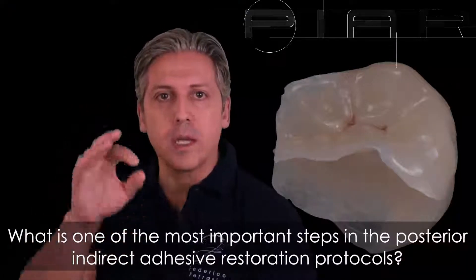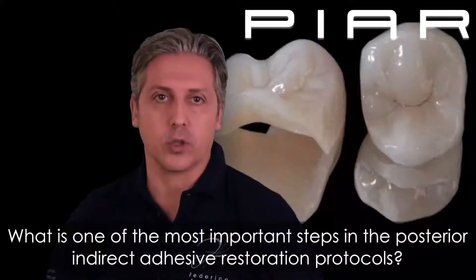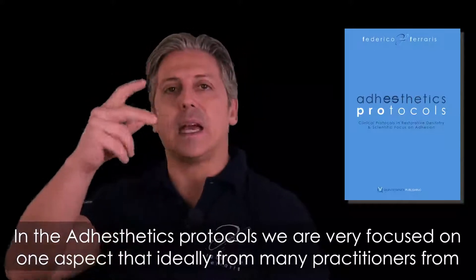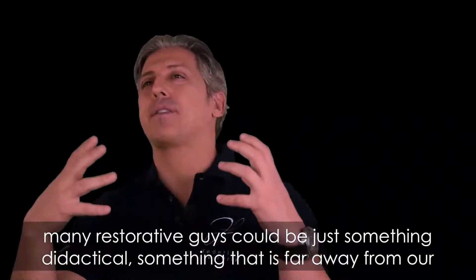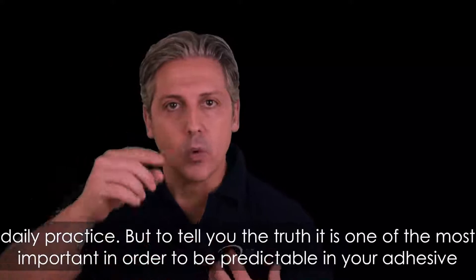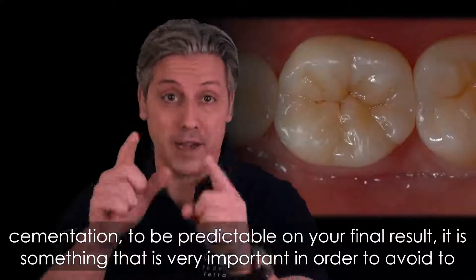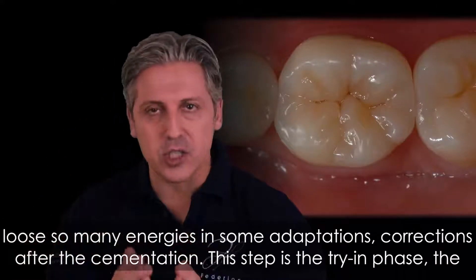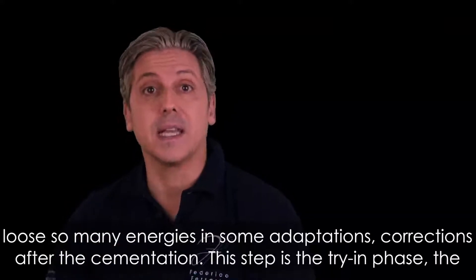What is one of the most important steps in the posterior indirect adhesive restoration protocol? In the adesthetics protocol we are very focused on one aspect that, for many practitioners and restorative guys, could be just something didactical, something far away from daily practice. But the truth is it's one of the most important steps to be predictable in your adhesive cementation and to avoid losing energy on adaptation and correction after cementation. This step is the try-in phase.